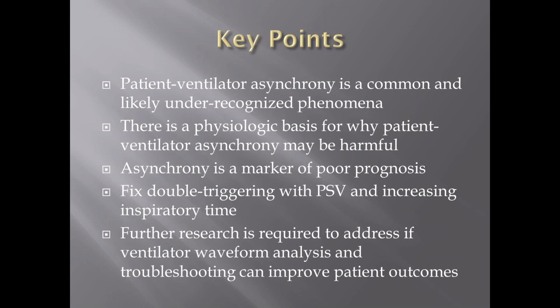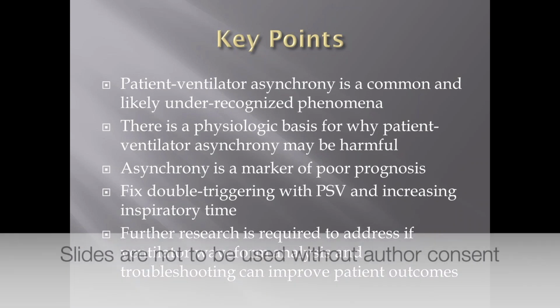We just know it's common and associated with bad outcomes, but we're not sure if the interventions we're making are actually helpful. Interestingly, this guy I went to med school with, as part of the ROSE study, the recent paralytic study, did a sub-study where he actually monitored the waveforms of patients getting paralytics and not. I don't even know if he's looked at the data yet, but we're going to have a little more of an idea of whether paralytics are helpful in terms of the waveform aspect.